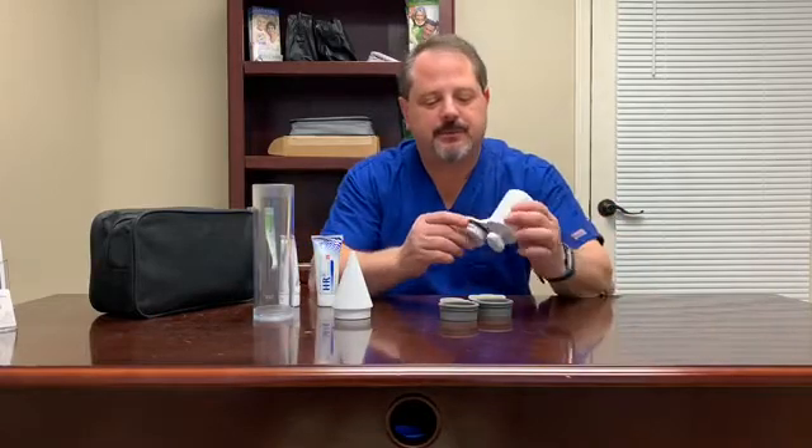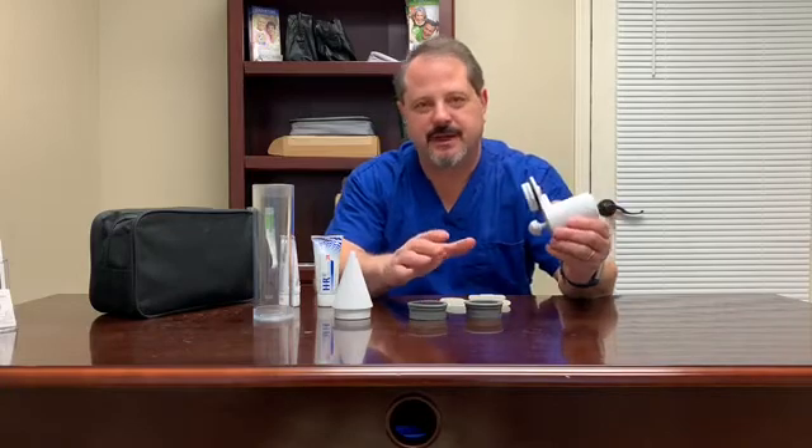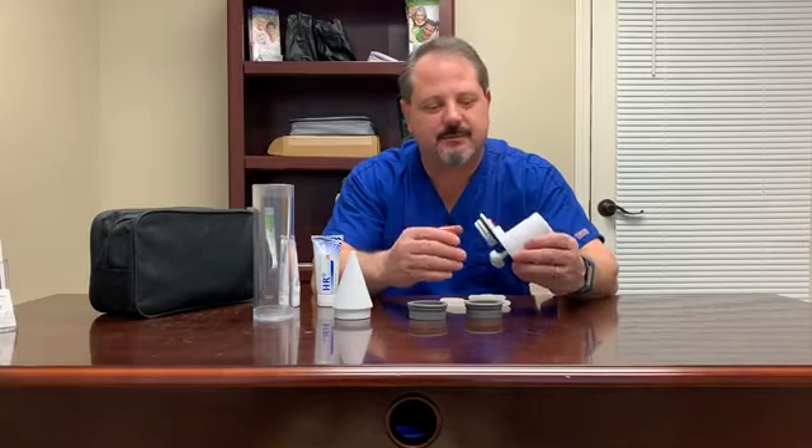Also included is the pump and two sizing adapters to go into the end of the cylinder, so you can change the diameter at the end of the product if you need to size it down or size it back up.